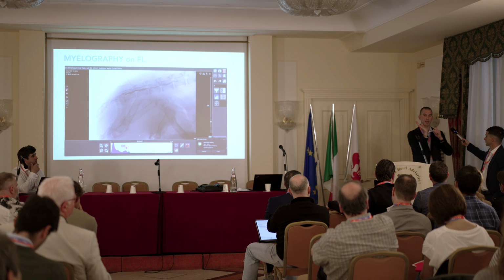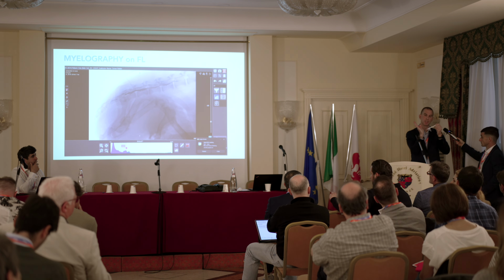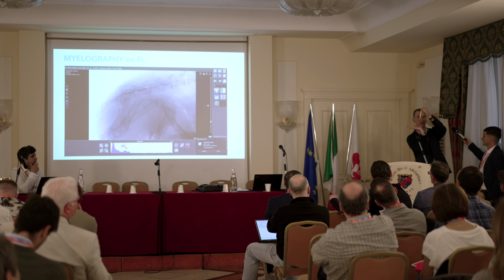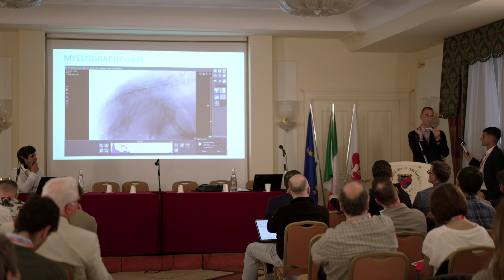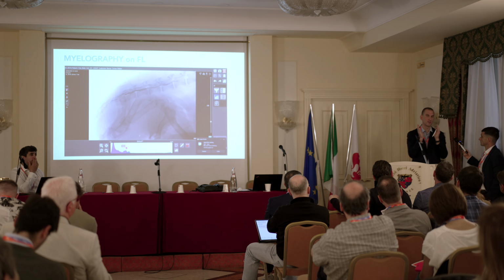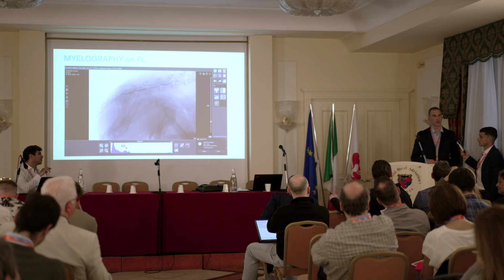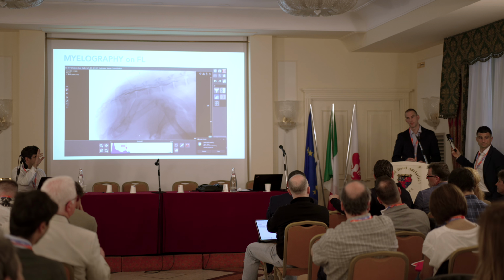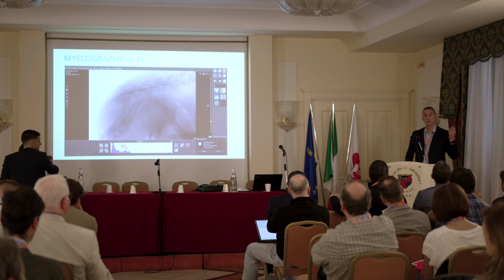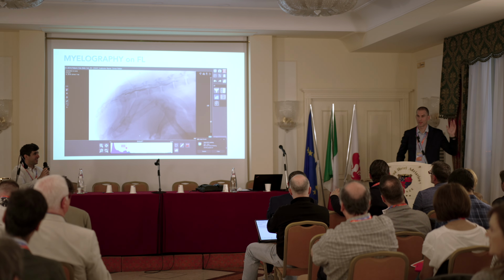If this is the body and here are the vertebral spinous processes, it's easier to go this way than this way. So it helps a little bit, and you can open the intervertebral space a little bit. So yeah, this is a small trick on how to be better. I'm a left-hander, so I use the orientation head here and belly here. So that's other.